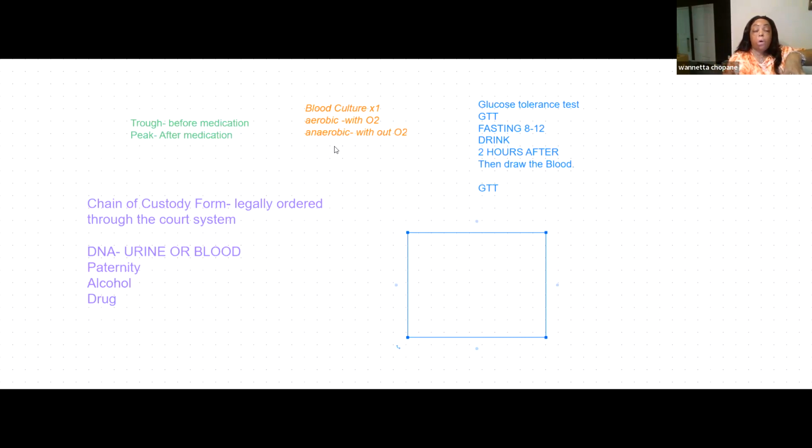We also just went over how to collect blood and specimens in a special way. Now you need to know how to process it, which is just simple: putting it in the biohazard bag, reading the requisition, putting the requisition. So we'll do that. Then after we do that, we'll get into our live blood draws for the majority of the day. I will have 2 former students come in to get more practice.